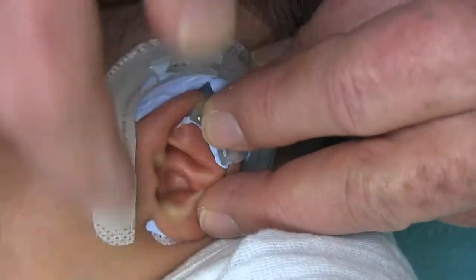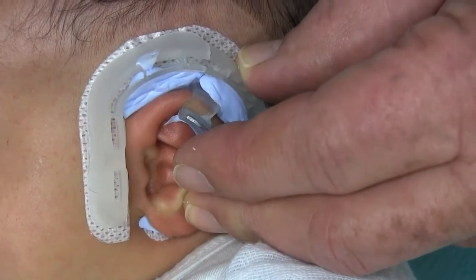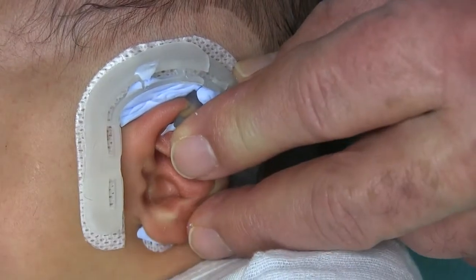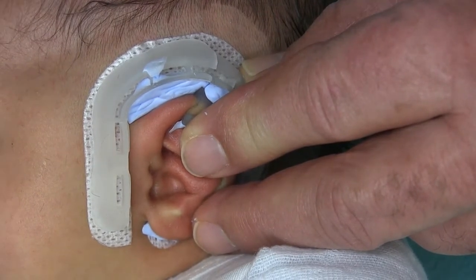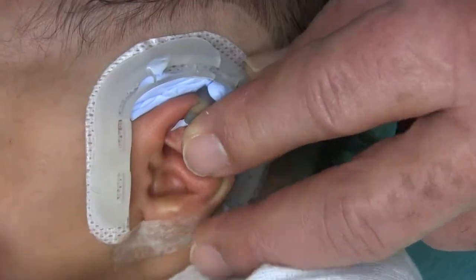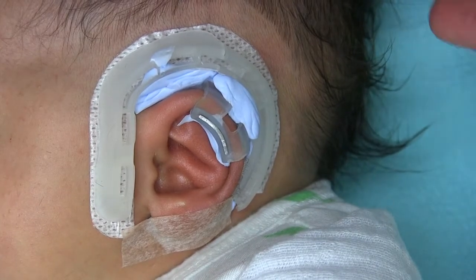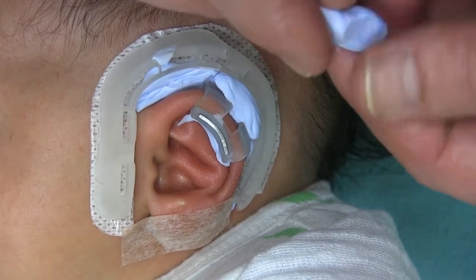I'm okay with putting that tape across there now too. Very good. I'll mix that while you're doing that. And what I need to do is push this part up a little bit where that triangular fossa is, and then take a moulage with the concha. Maybe we can do that at the same time.